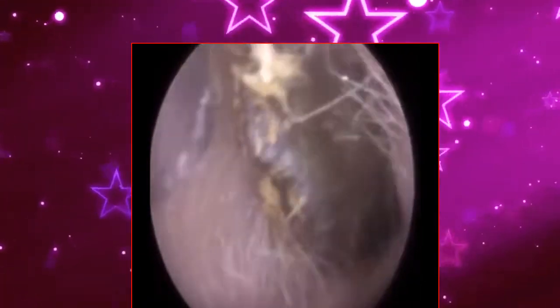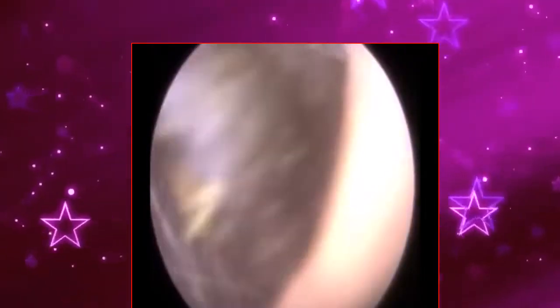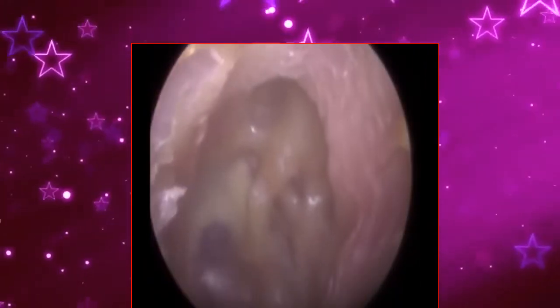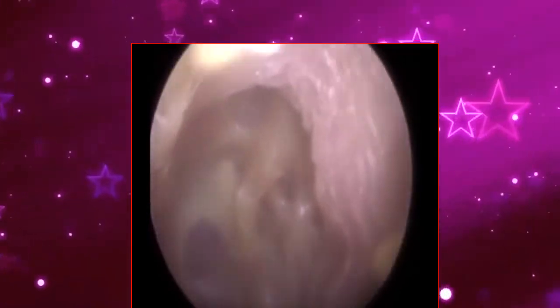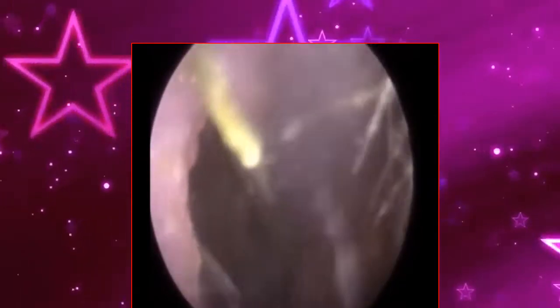And I don't think I've uploaded a video showing an eardrum like this before, and an enlarged medial external auditory meatus. So external auditory meatus is the name given to the ear canal, and medial is deep in the ear. And you can see there, you can see the eardrum. There's a bit of dead skin, a bit of wax on the side that I'm going to remove.